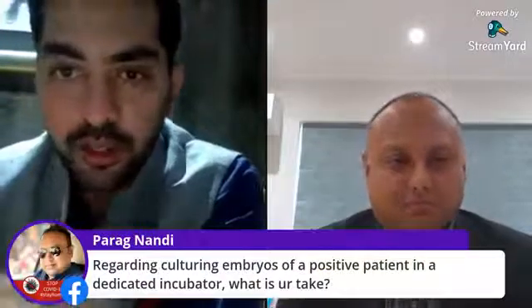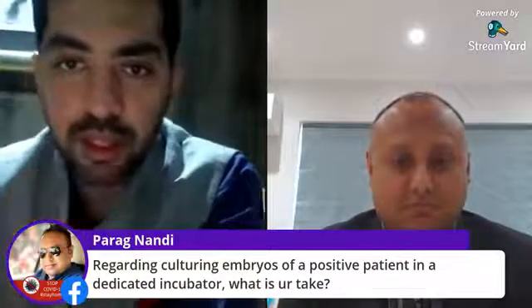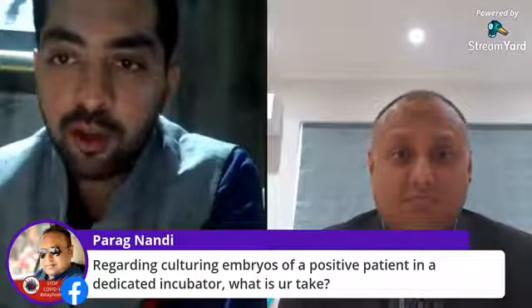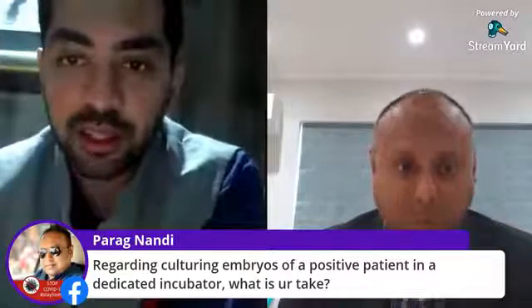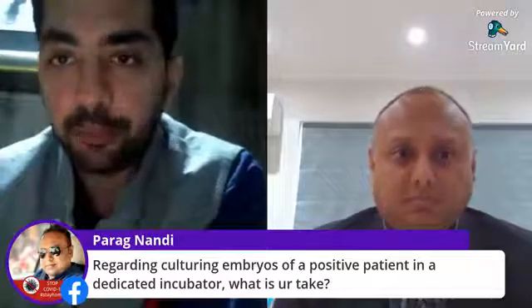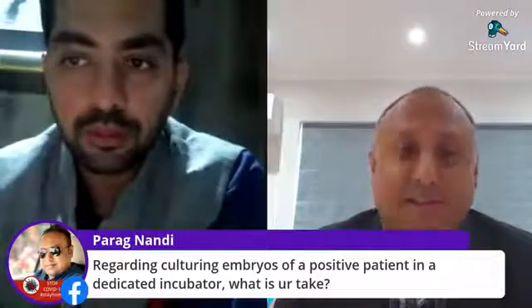Now, let's take a few more questions, and then I think we can finish. We have about 6-7 minutes left. Parag here has a question. This is an inevitable scenario for all of us in the coming months, where we might get positive patients in our clinics. So should we dedicate equipment for them? The answer is yes.